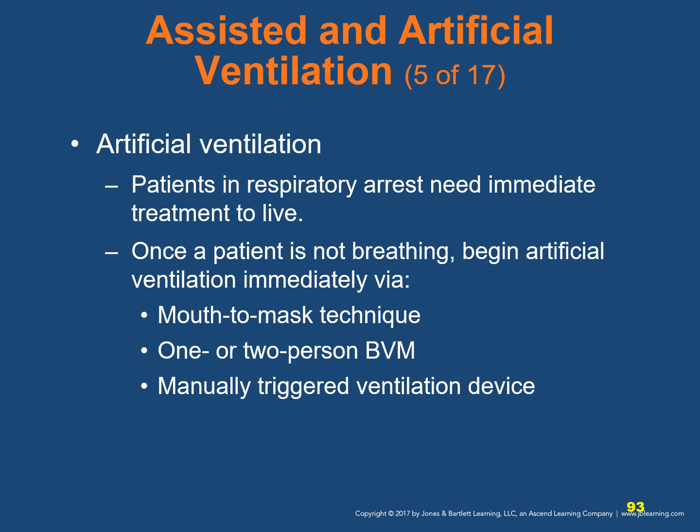Patients in respiratory arrest need immediate treatment to live. Once you determine a patient is not breathing, begin artificial ventilations immediately. Available methods are mouth-to-mask technique, one or two person BVM, or a manually triggered ventilation device.